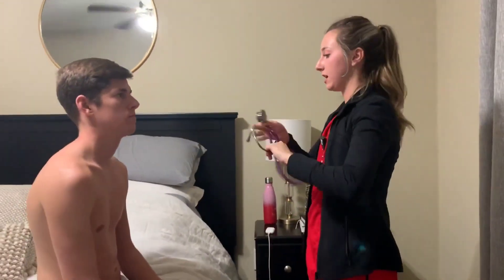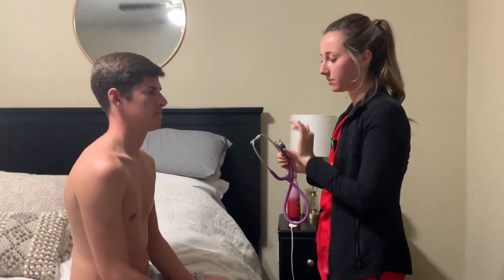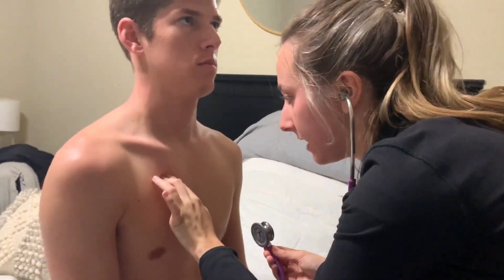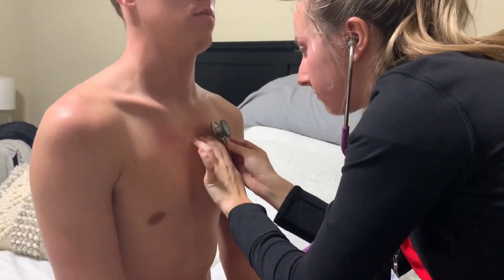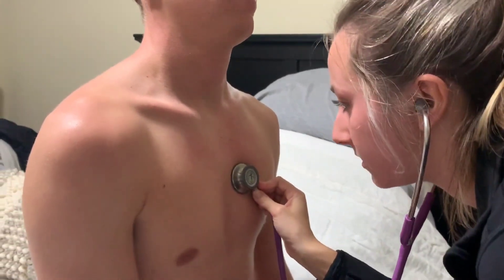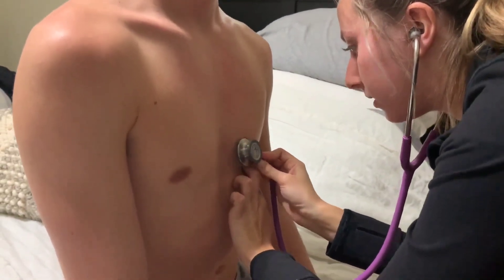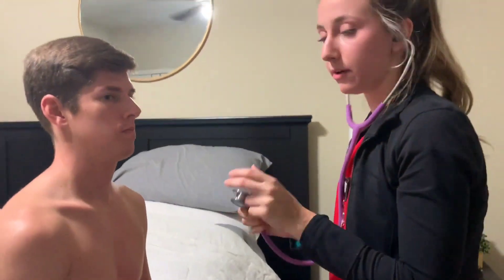It sounds like a gentle tapping sound. Now I'm going to auscultate for all the heart sounds — using the diaphragm and the bell, making sure all pieces are clean. I'd palpate down to the right second intercostal space and listen for the aortic sounds, then on this side for the pulmonic sounds, then down to the third intercostal space for Erb's point, then at the left lower sternal border for tricuspid, and over here for the mitral at the fifth. Then I'd switch to the bell at the same spots.